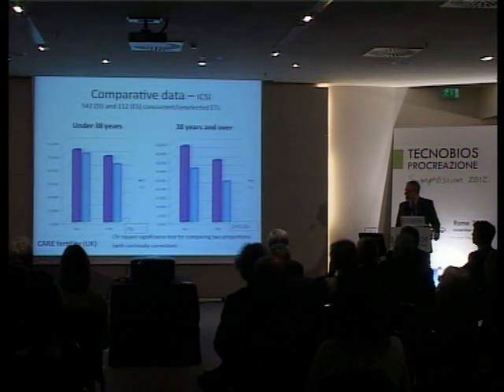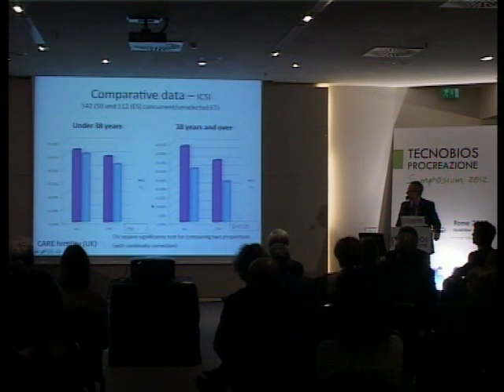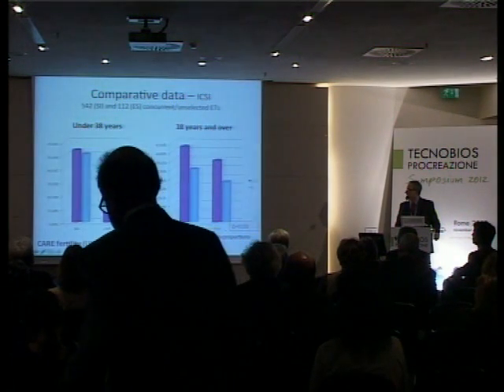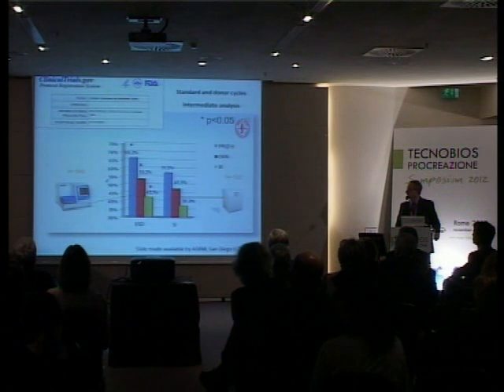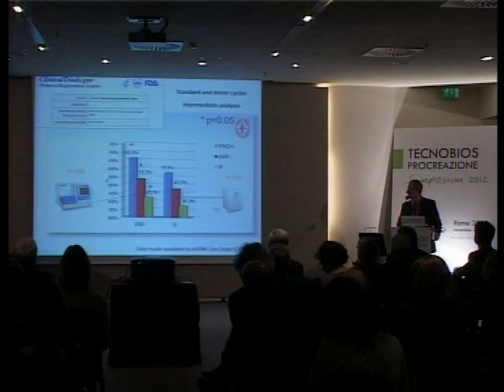And again, the Care group has also assessed this approach of embryo selection through time-lapse microscopy, and you see how, I mean, the data are quite clear. It seems that there may be an effect in older age patients comparing EmbryoScope and standard incubation, and this effect in fact disappears when younger patients are observed. And there is a study ongoing, prospective, in this case a randomized trial by the EVI group, but this is still ongoing, and final conclusions cannot be drawn, but there is a suggestion that there may be an effect of time-lapse microscopy for selecting better quality embryos.